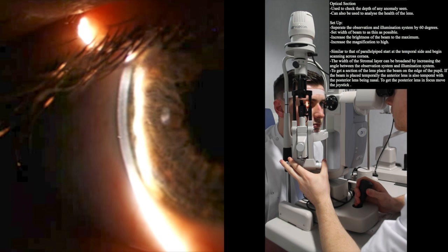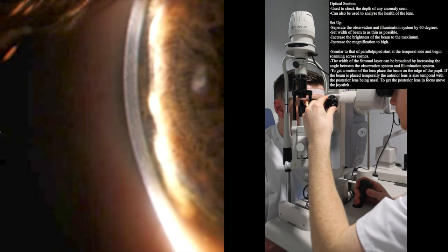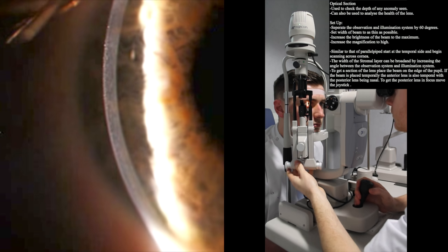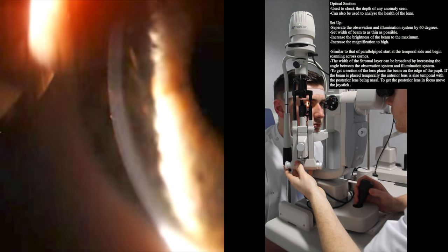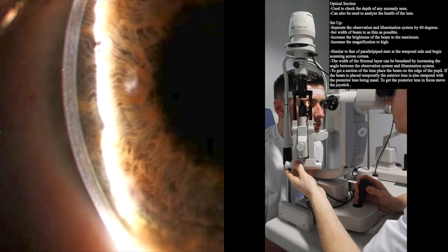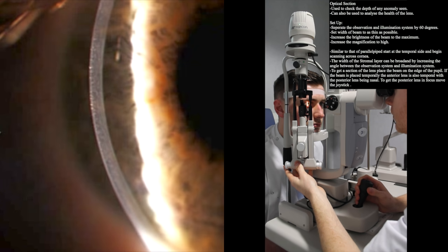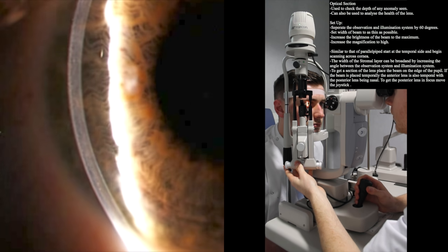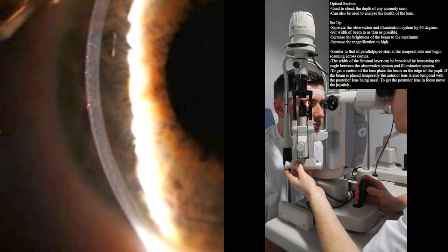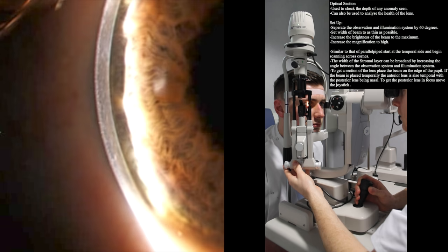Increasing the magnification will allow us to see the three main layers of the cornea in better detail. You may have to move the joystick slightly to get the layer of interest in focus. The section of the stroma can be broadened by increasing the angle between the illumination system and observation system.